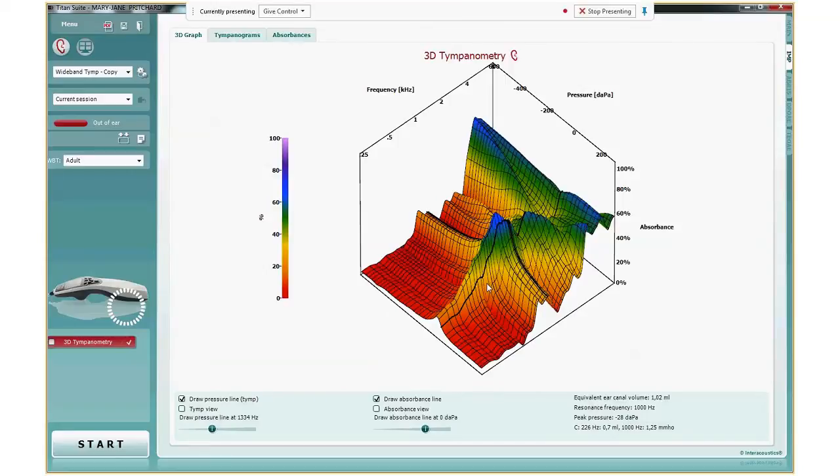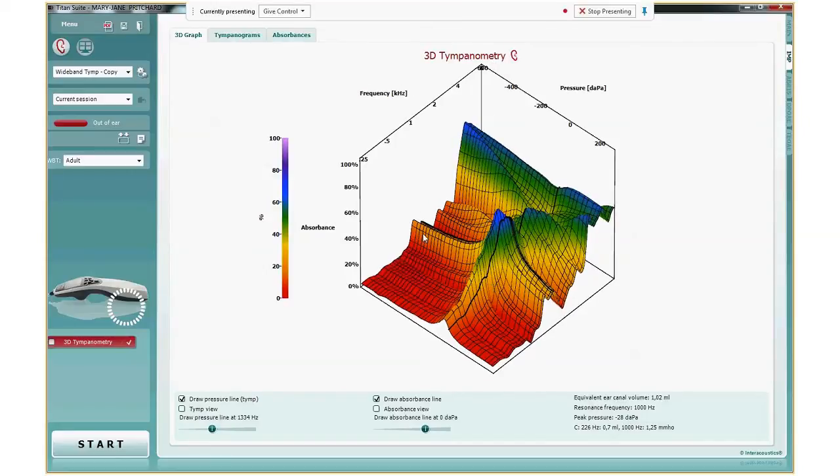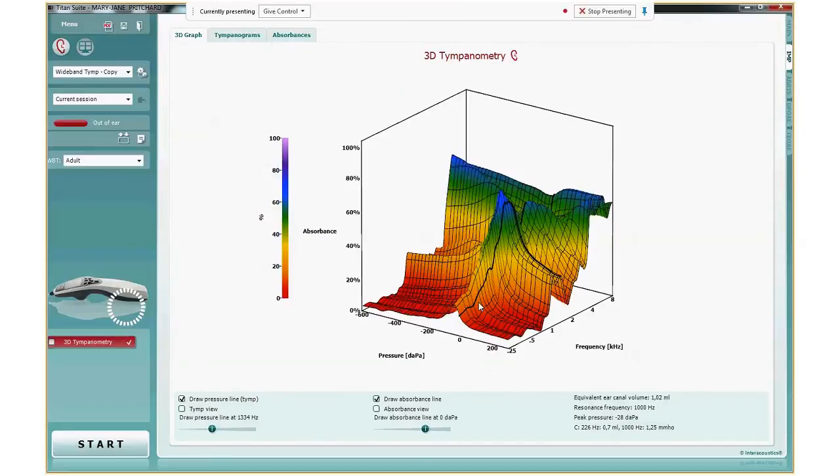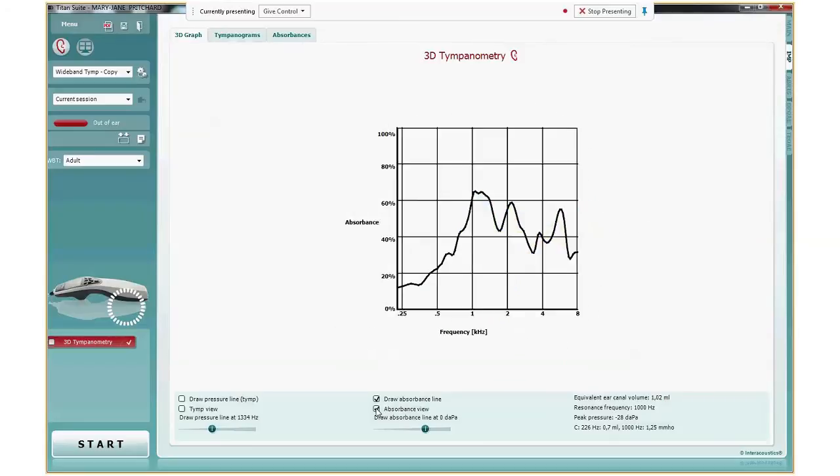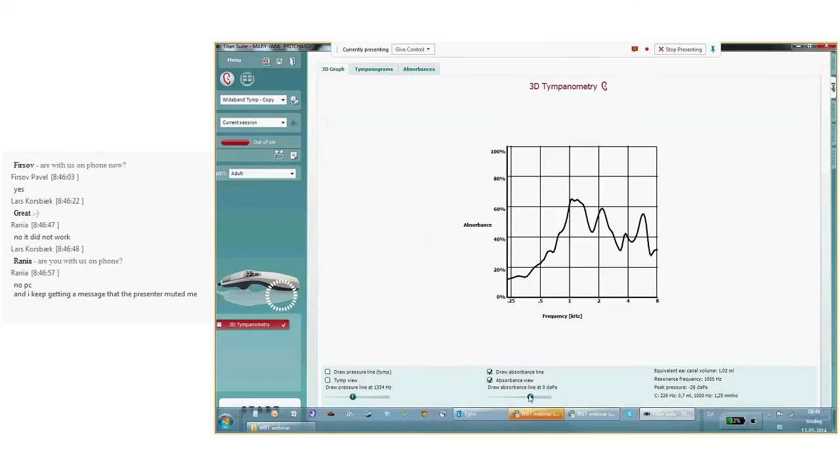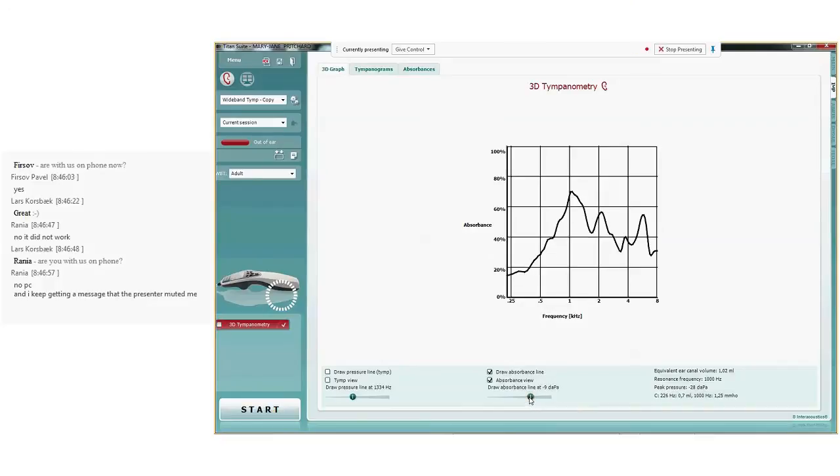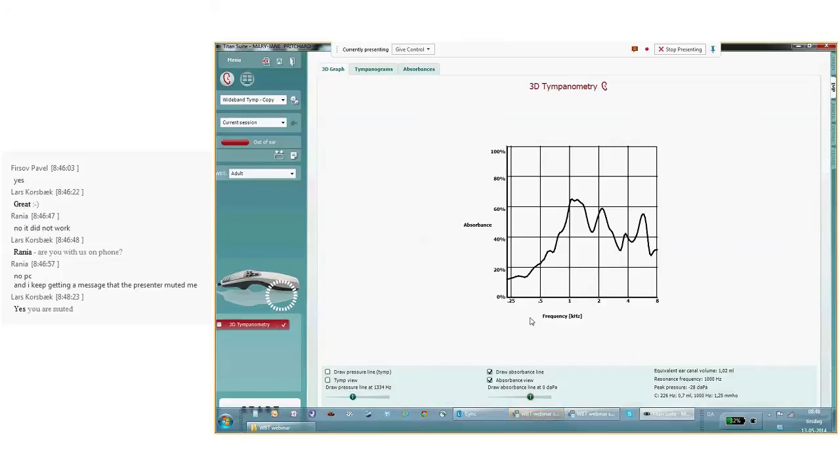I go back to the 3D graph in the Titan Suite. So far I only showed the tympanograms. And we can see there is also a line in the other direction. And I can isolate that line by clicking absorbance view, like this. Here we see the absorbance as function of frequency, and the absorbance is taken at 0 dkPa, so this is at ambient pressure. And I can move it, for example, to my peak pressure. My peak pressure is just next to it at minus 28. But at peak pressure and at ambient pressure, that is the most interesting slices to look at.